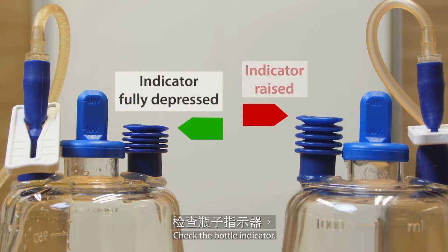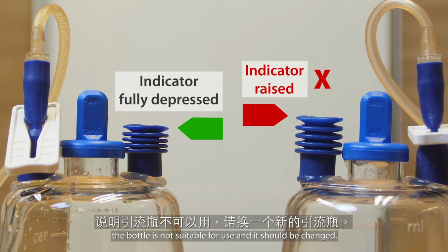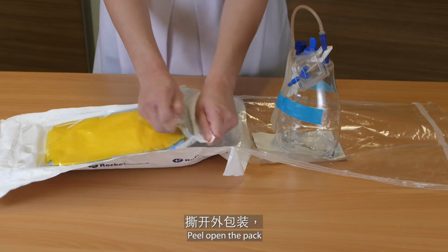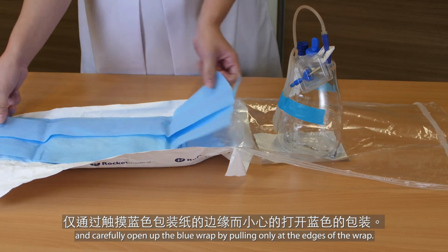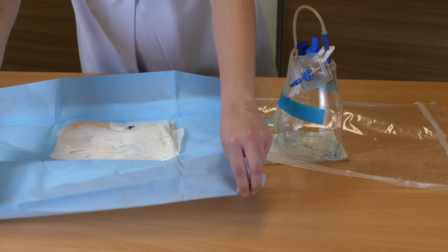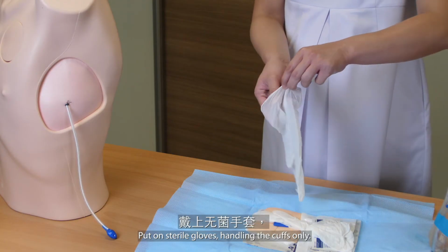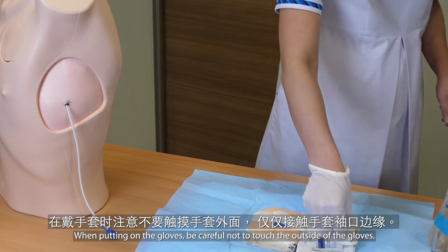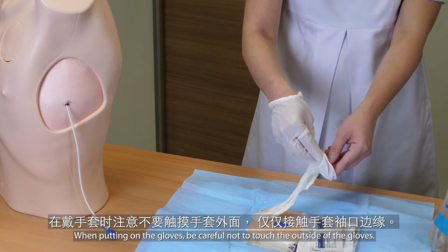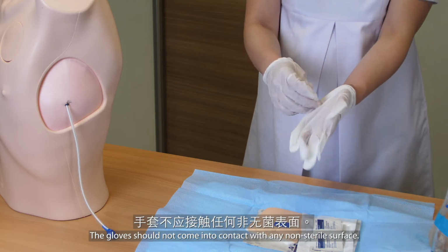Check the bottle indicator. If it is raised like the bottle indicator on the right, the bottle is not suitable for use and it should be changed. Peel open the pack and carefully open up the blue wrap by pulling only at the edges of the wrap. Clean your hands thoroughly. Put on sterile gloves, handling the cuffs only. When putting on the gloves, be careful not to touch the outside of the gloves. The gloves should not come into contact with any non-sterile surface.